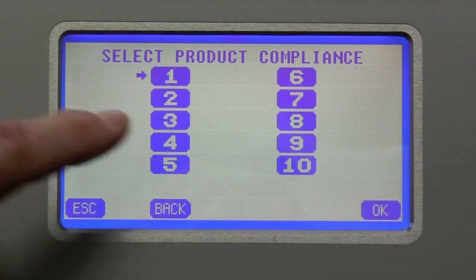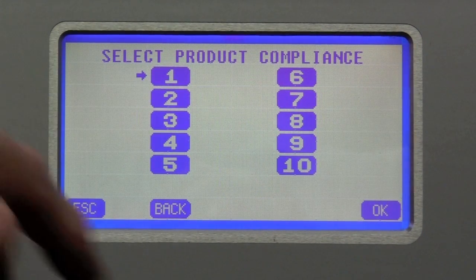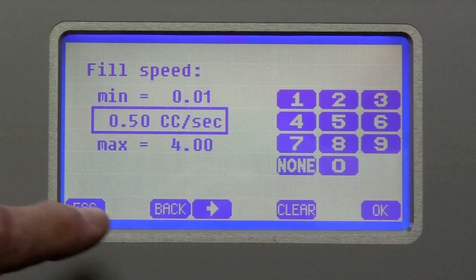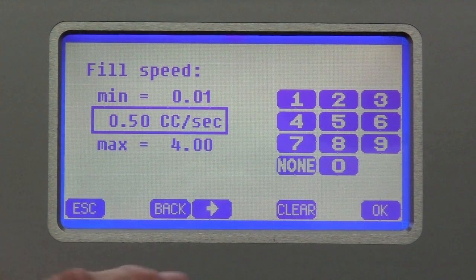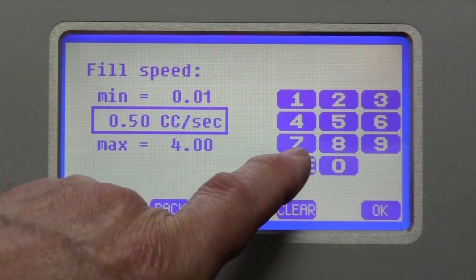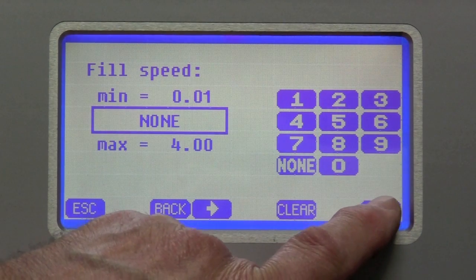And the compliance is 1 because the part is very rigid. And we have actually pre-filled this so we don't need to fill it. So we can say no. Some products do, some don't.